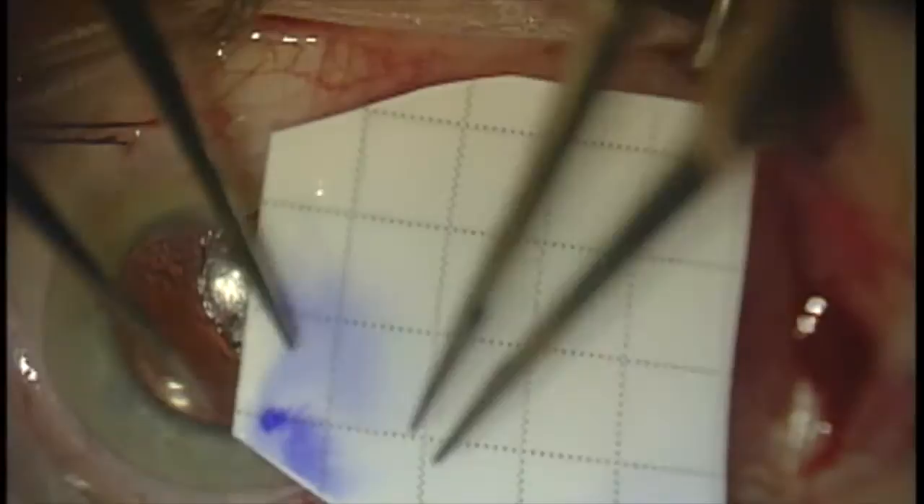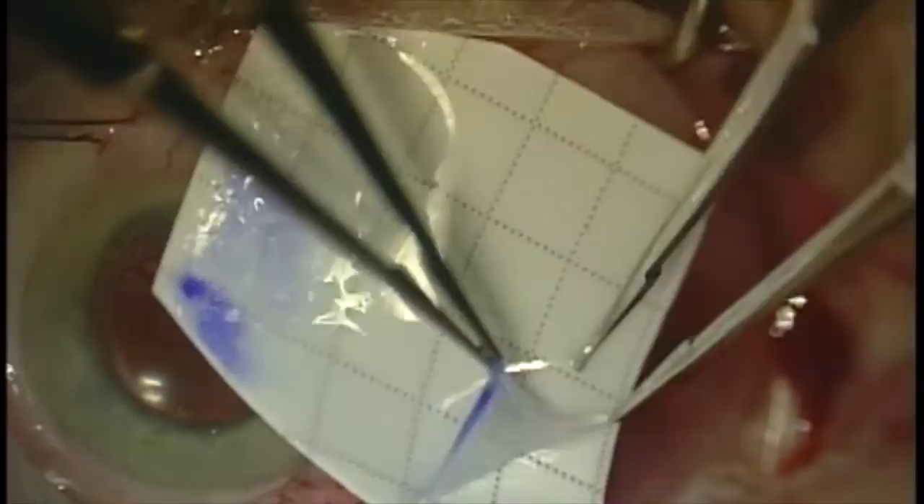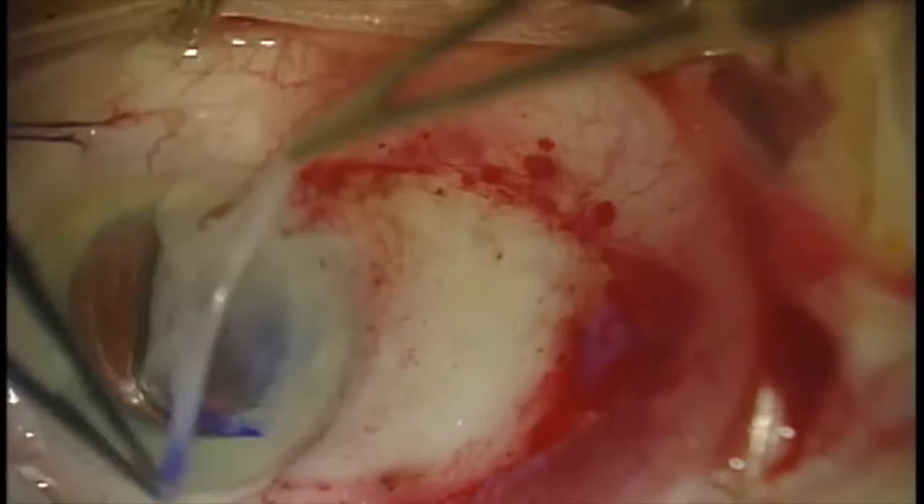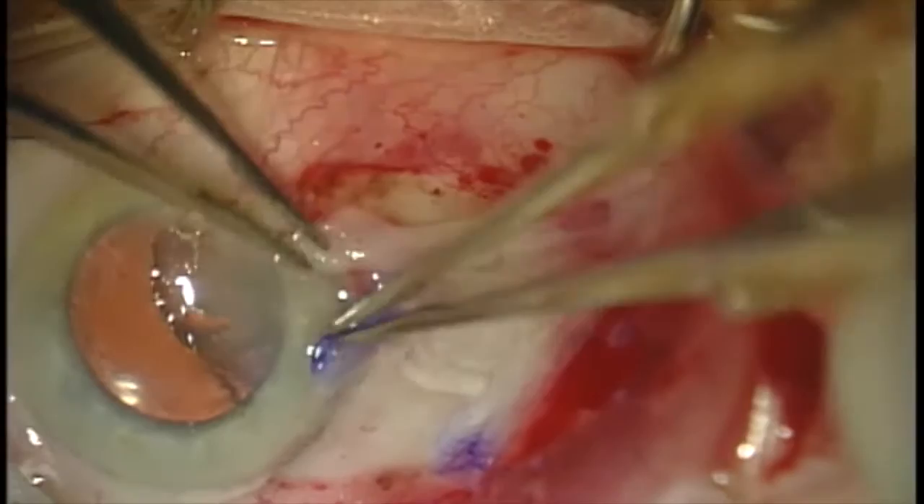After the eye is rinsed, we go ahead and create an amniotic membrane graft that's appropriately sized. Now we're going to peel the graft from the paper that it comes adherent to. The stroma side is down, and that's the orientation we want when we're done. We peel the membrane off the paper onto the cornea, keeping it nice and flat, and then quickly flip it over.